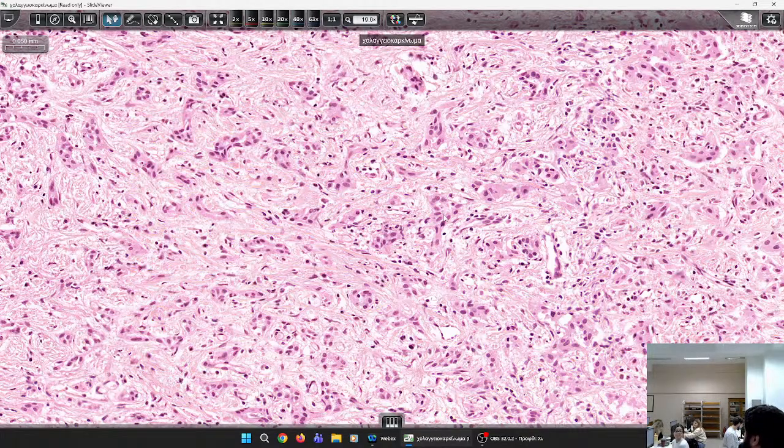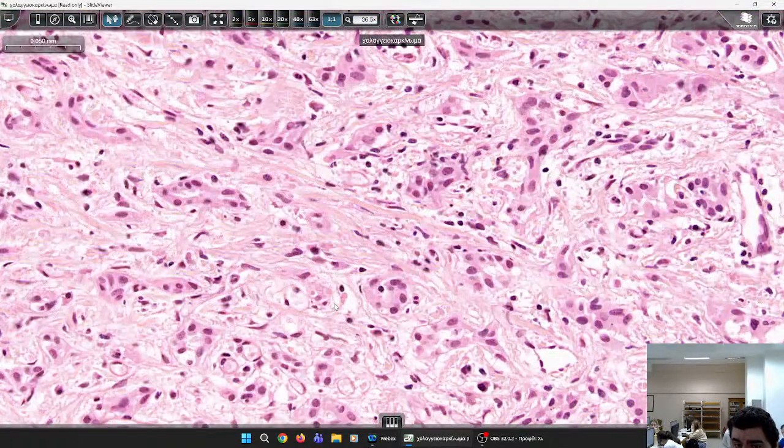When you have a biopsy, where you don't have the whole tissue and you have to make the diagnosis, a very helpful stain would be EMA. EMA stains all cholangiocarcinomas, but in a different pattern. When it's a large duct type, you can see membranous, whole cell or cytoplasmic staining, but when it's a small duct type, the EMA would stain only the apical surface.